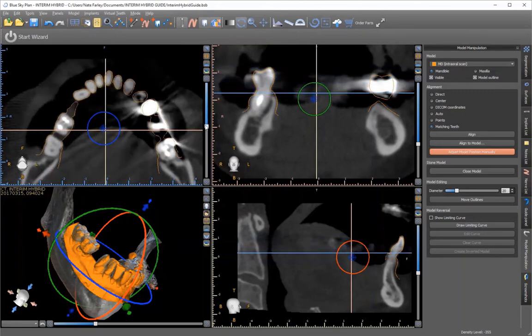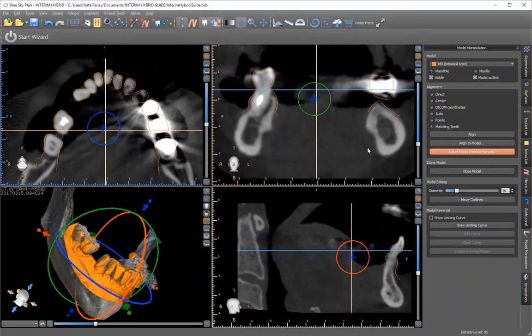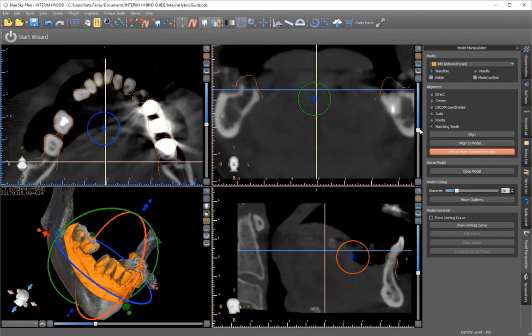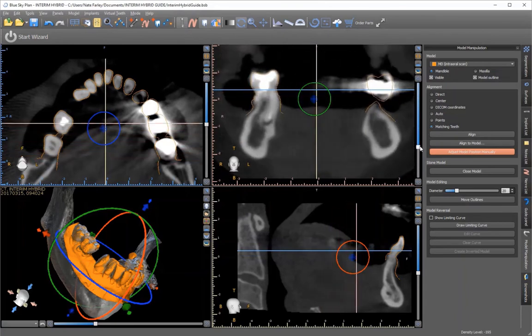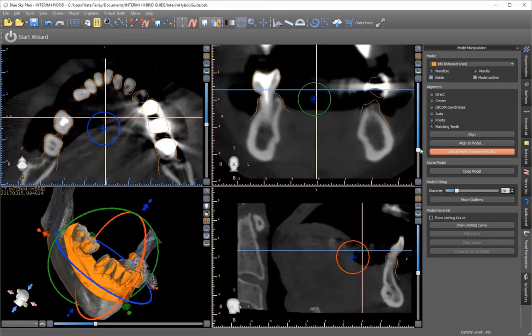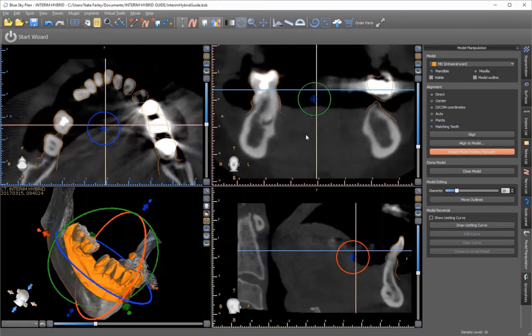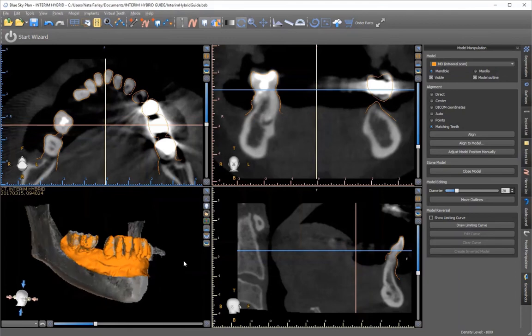As you scroll through some of these different views, you're just looking to see that the outline of the STL file aligns with things properly.